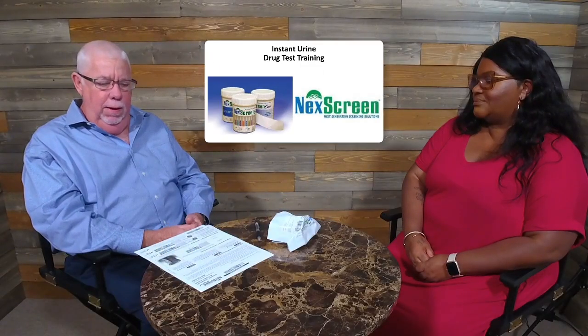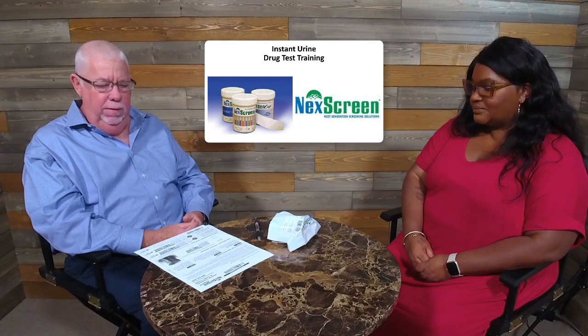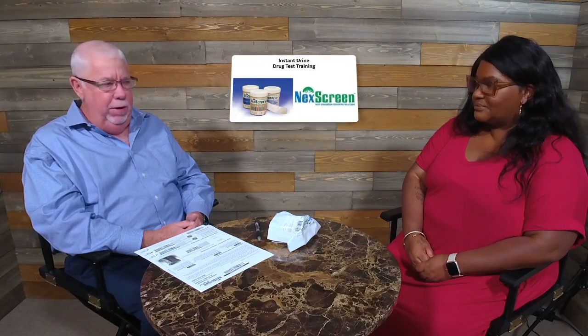Hi, my name is Joe and I am going to be demonstrating the Next Screen instant drug testing product today. I have my donor Char — welcome, Char. We're going to talk about the Next Screen instant drug testing product, go through some instructions on the collection of urine and reading the result, and in some cases the result might be inconclusive, and in those cases we are going to package up the specimen and send it out to the lab for confirmation testing.